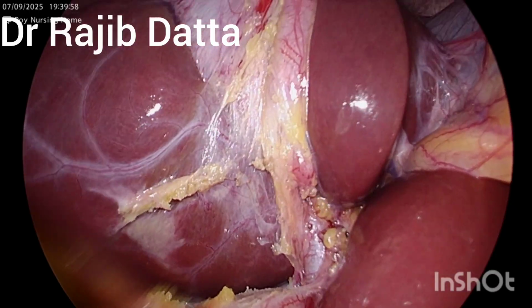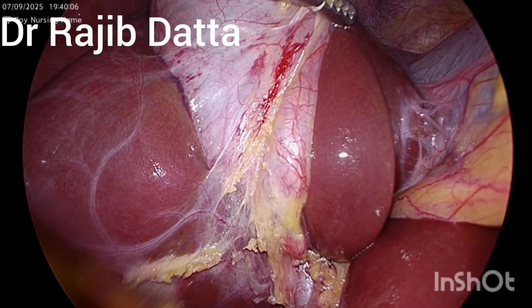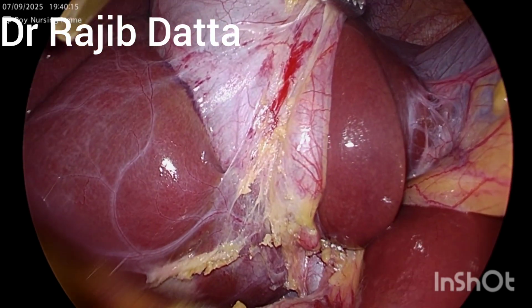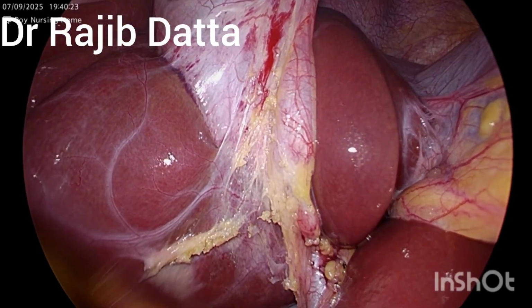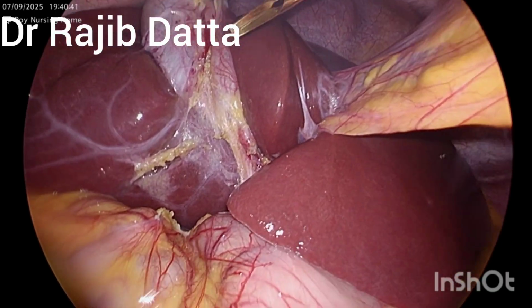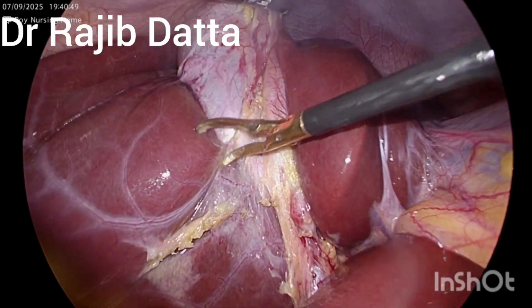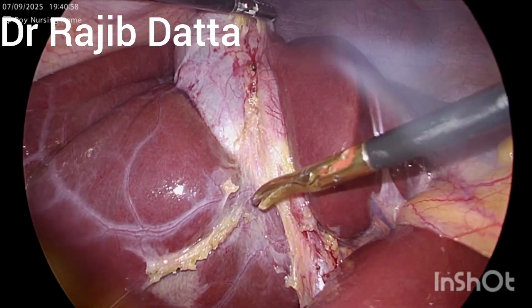So with the help of the sharp tip of this Maryland forceps, we are trying to separate it. Now the bipolar shearer is in and it will make our job to some extent easy. It will make the job so much easy and chances of lateral thermal damage will be minimized. It is one of my favorite instruments. So again, adhesiolysis and hemostasis at the same time can be achieved.